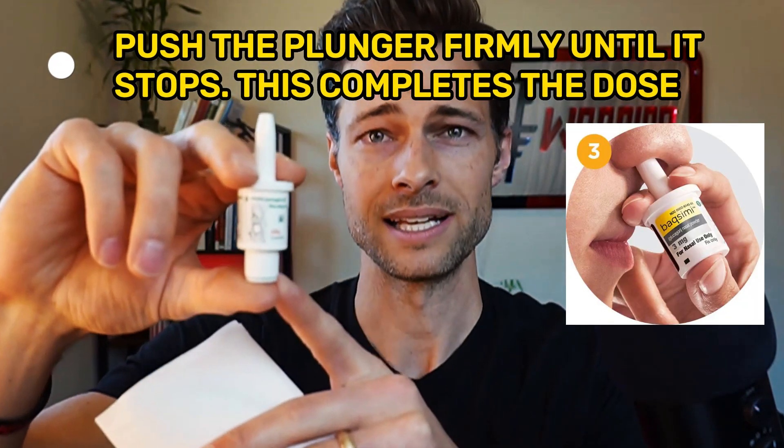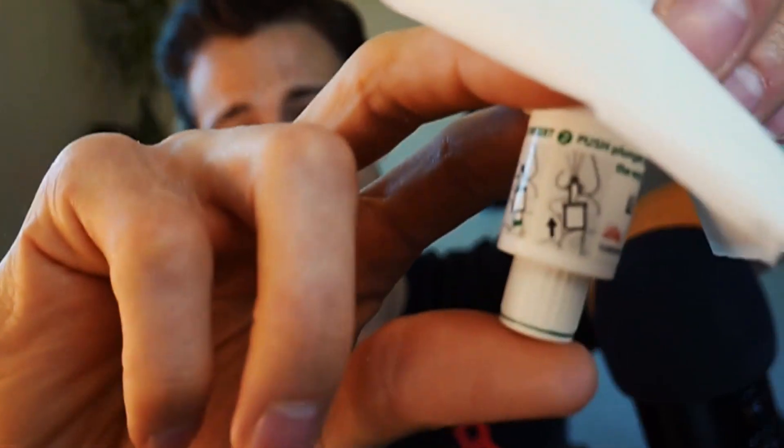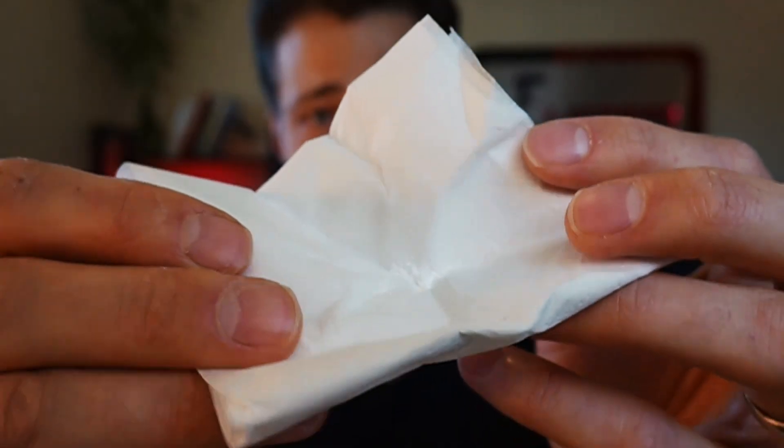I'm not going to push the plunger in my nose, but I will push it to show you what it looks like. I pulled out some tissue from the bathroom because I'm curious what this powder looks like. The dose is complete when the green line disappears — when it's up inside the housing. Here we go. Whoa! That got everywhere — all over my laptop. There is a good chunk of powder. Now I know what it looks like, and I'm praying none of that got in my nose. It's expired, so I'm counting that as less risky. So beware — it'll be in your nose.